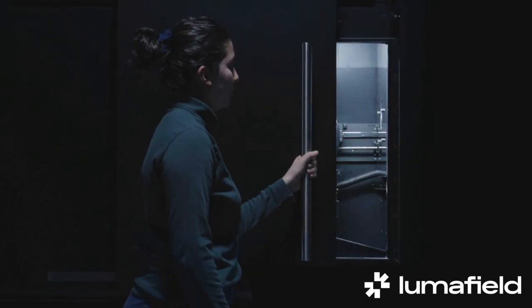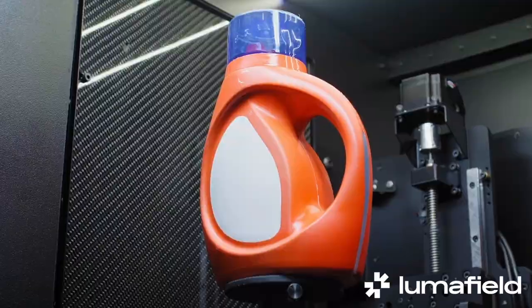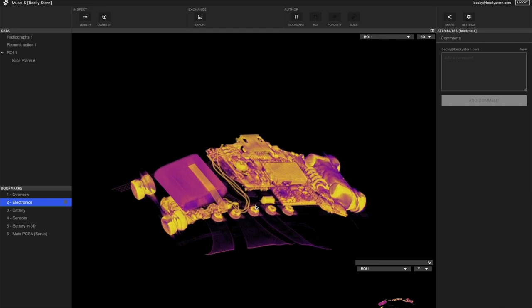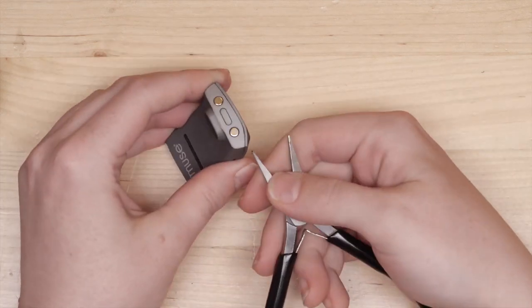Before I took apart my Muse S, I sent it off to be CT scanned by the folks at Luma Field. They graciously agreed to scan another teardown gadget for us, so we can see the insides in their intended state. We'll come back to these scans later. Now onto the part you came here for — the taking apart.